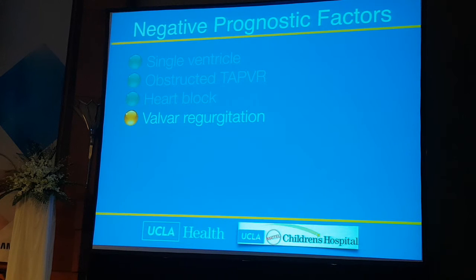Some patients have significant valvular regurgitation early on, at 18 weeks, 20 weeks, that you can pick up with power flow imaging. Valvular regurgitation early on, in the second trimester, is not a good sign. It's another negative prognostic factor.